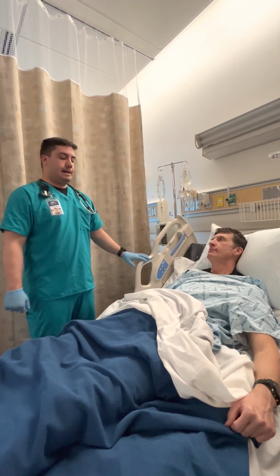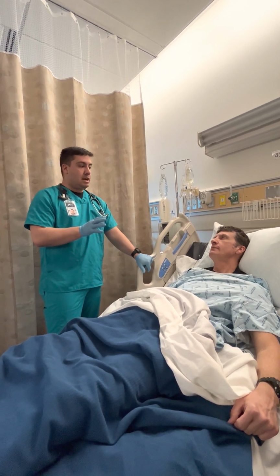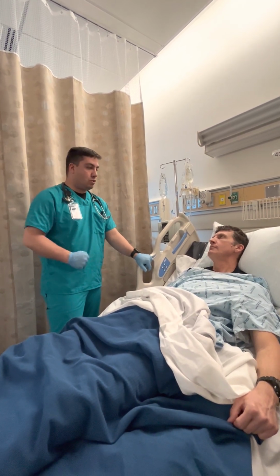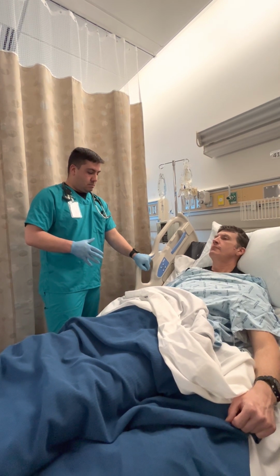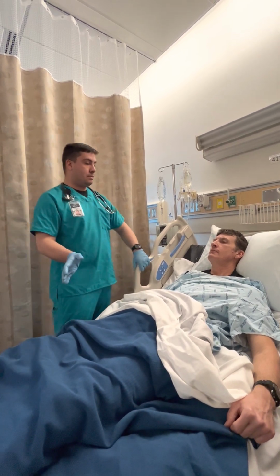All right. If I did identify an IV site, I would make sure that it's clean. There's no infiltration noted, no redness. I would keep it as clean as possible with a Tegaderm around it and secure it appropriately with tape or an occlusive dressing. Okay. I had forgotten to ask, so I'm going to ask now.